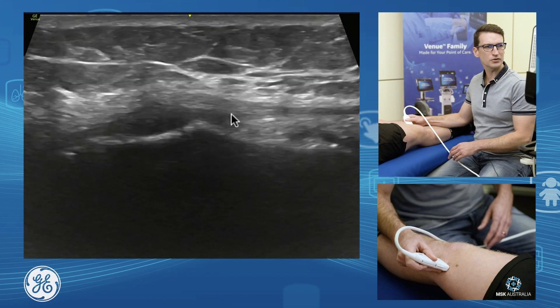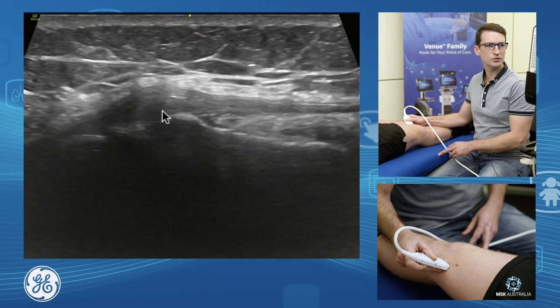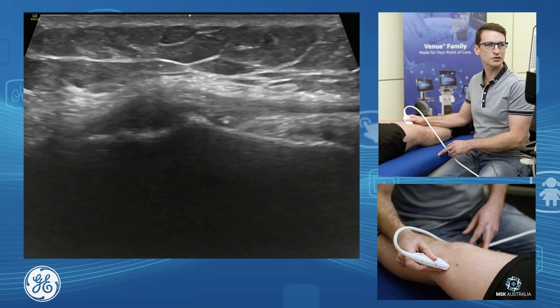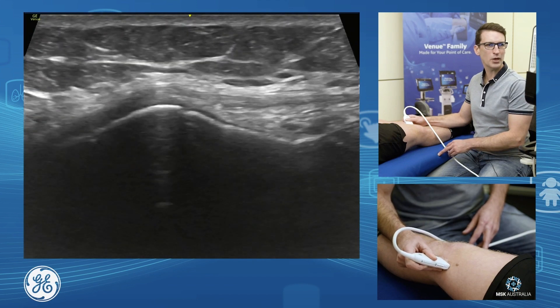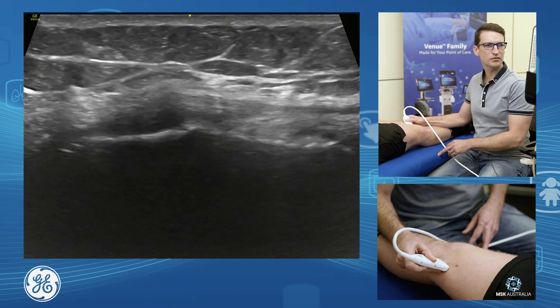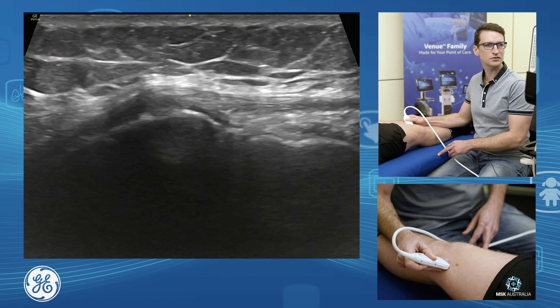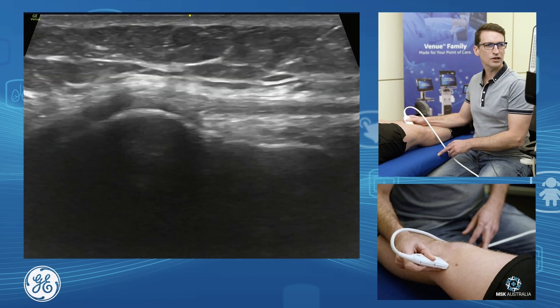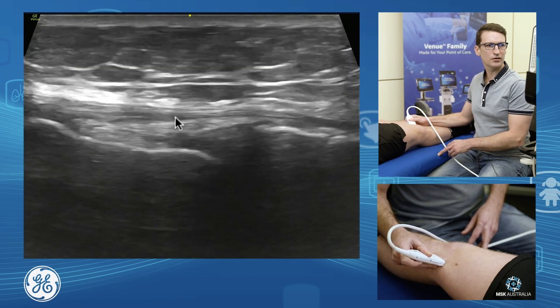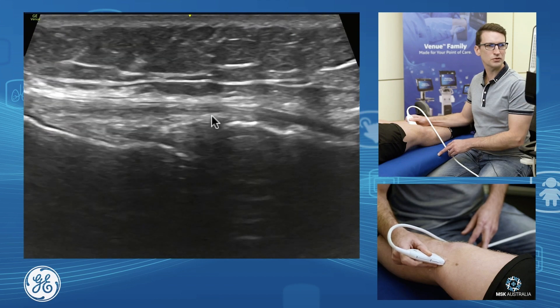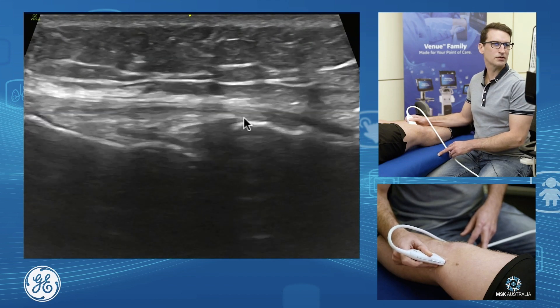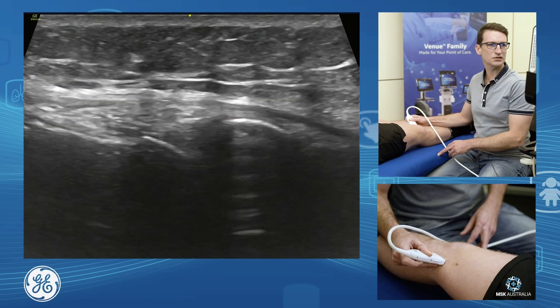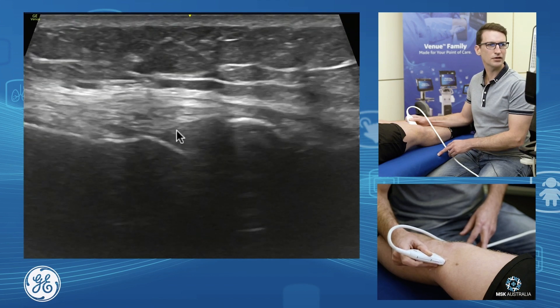We come up and want to assess our origin — this is where quite a few of our strains will occur. We pan through there; it's quite a broad attachment, so we want to focus all the way across and cover that. As we come down and cross the knee joint, this is where we have our deep medial collateral ligament and our meniscus sitting just in under.